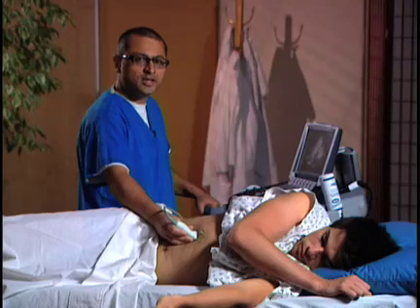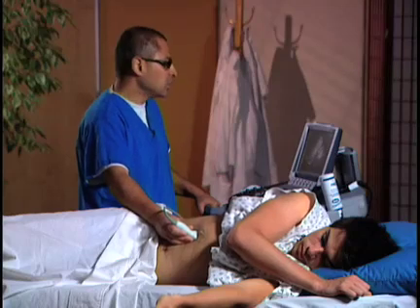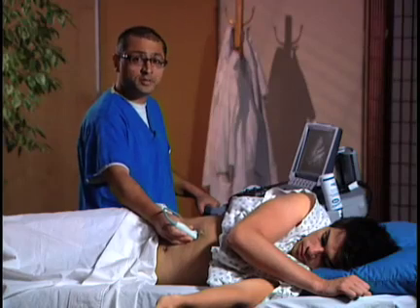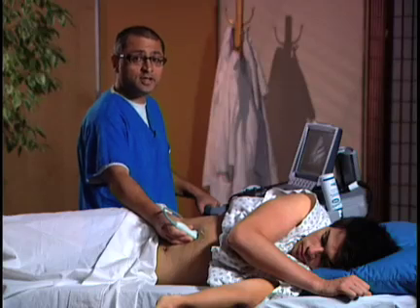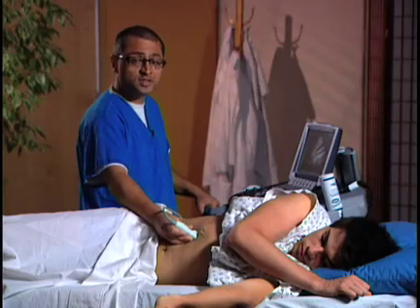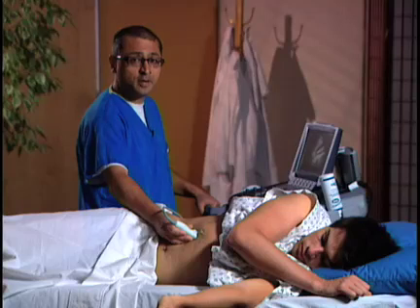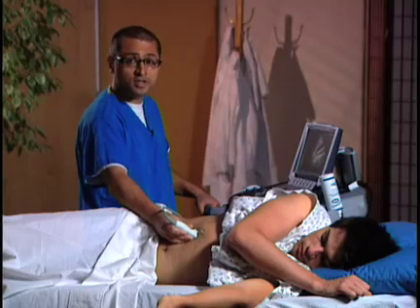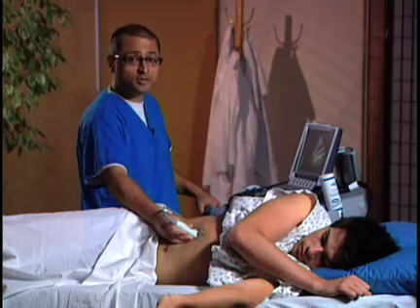When you're scanning, carefully look for signs of a gallstone. A gallstone will have a hyperechoic appearance — meaning it's going to be brighter in nature — and it's going to cast a shadow. A key point: make sure that the hyperechoic area you're noticing actually lies within the gallbladder. A common mistake would be to identify an area outside the gallbladder that looks just like a gallstone — that would be a bowel shadow.